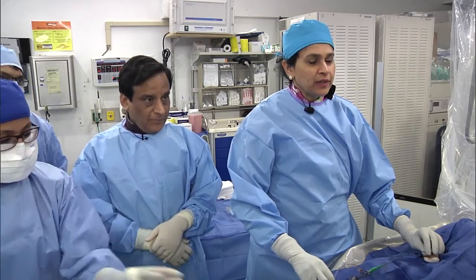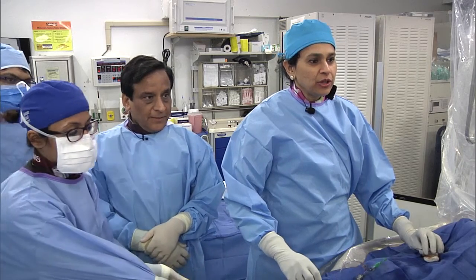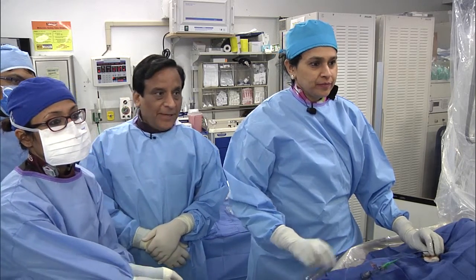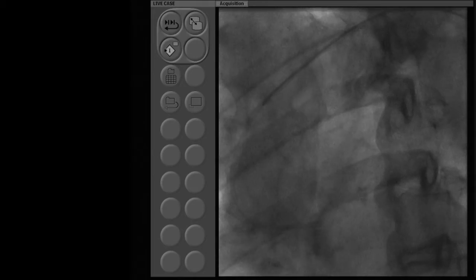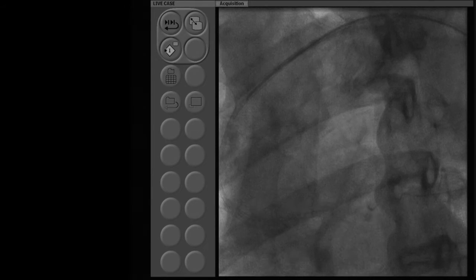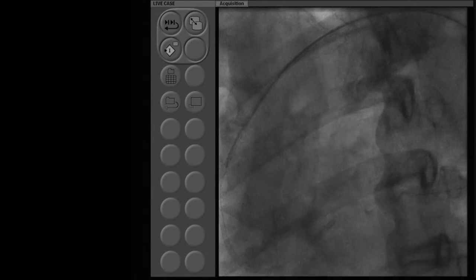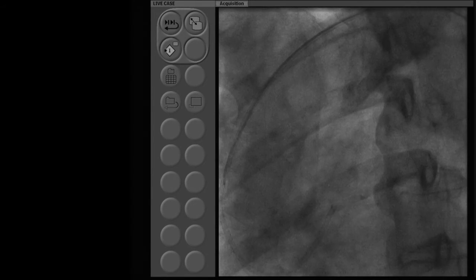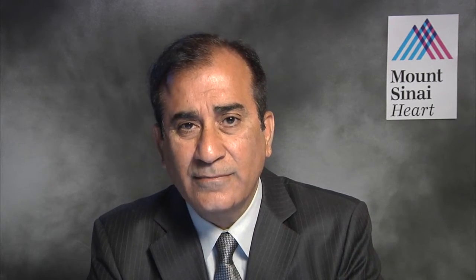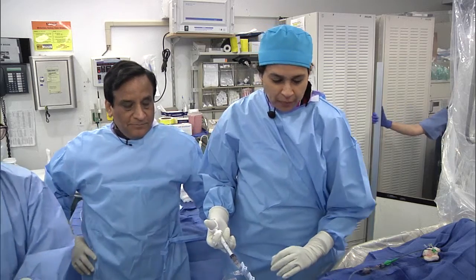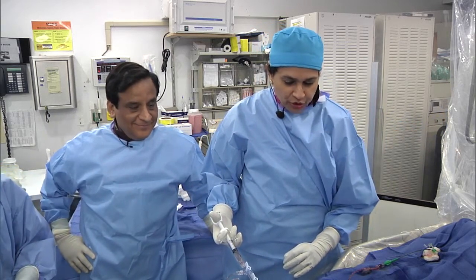The second issue — while Anu is getting the guide catheter ready for the FFR. The plan is to do the FFR of the LAD first and then the OCT. What would be your prediction of the FFR for the LAD? I would say positive. We all are predicting it's positive. We are going to show it live when adenosine starts dripping.